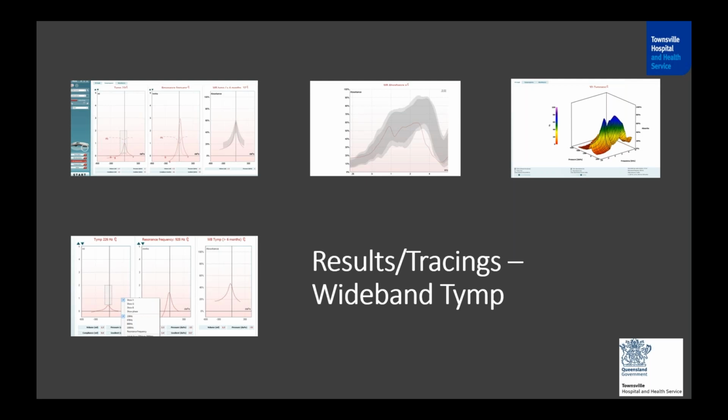Can I add on? I'm Vanaja here. Yes, Sri, it was an excellent presentation, thank you, with good clinical implications highlighted. This part of it, I don't know what exactly they meant by the question, but even when you're doing the normal reflexes, there is a slight gap between the probe tone and when the stimulus is presented, but still we say there are artifacts which can add up. Probably what happens here is it may add up or distort only at that one particular frequency. If I'm using 1000 Hertz for eliciting reflexes, only the 1000 Hertz absorbance gets slightly affected, but the other frequencies still give us the information. So we have an advantage here is what I would think.